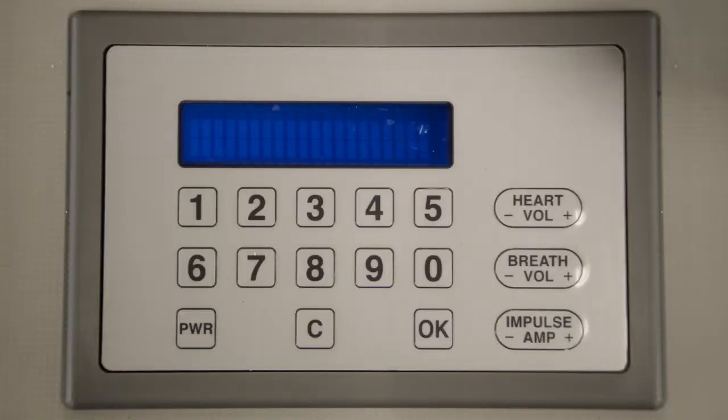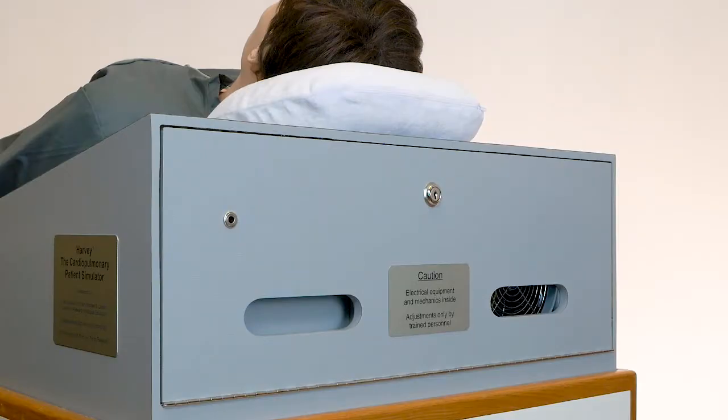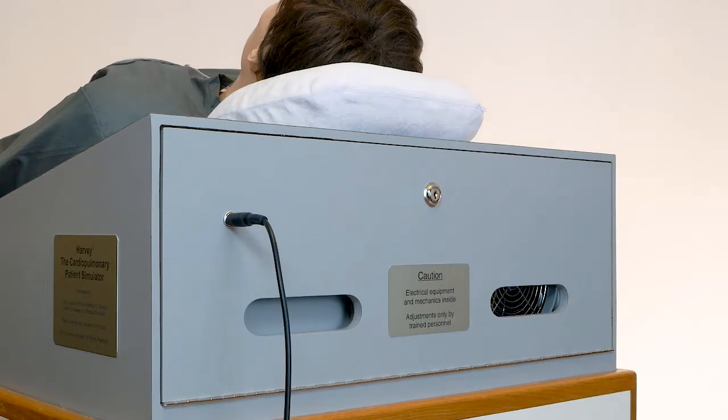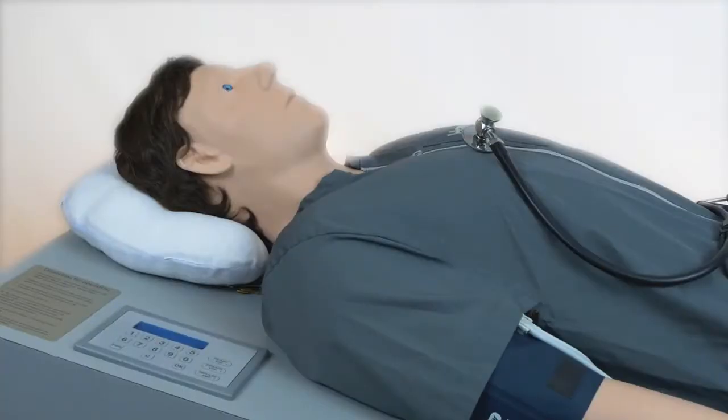Immediately after, you will see the keypad message: please wait while loading sounds. Harvey's audio outlet can be found at the left side of the cabinet door. Harvey's controls and indicators are found on the keypad on the right side of the head.